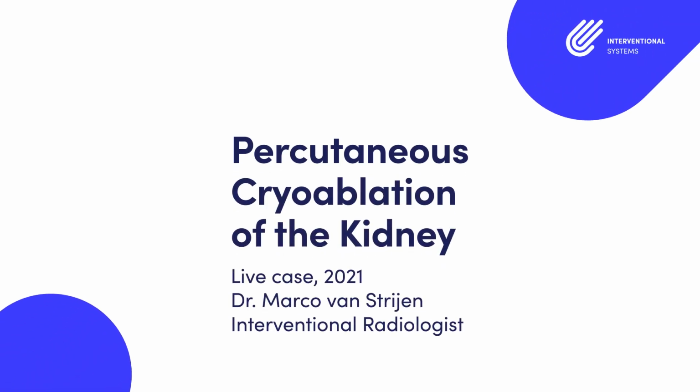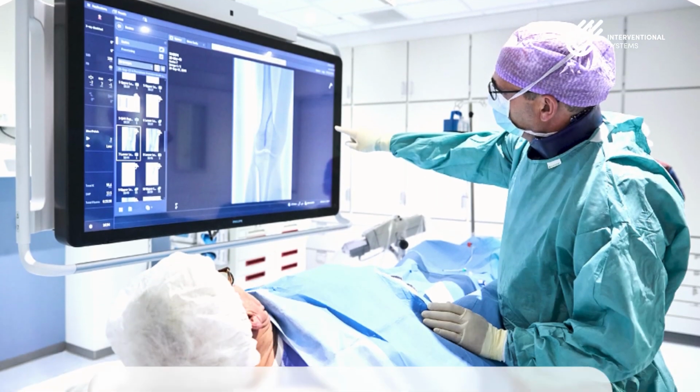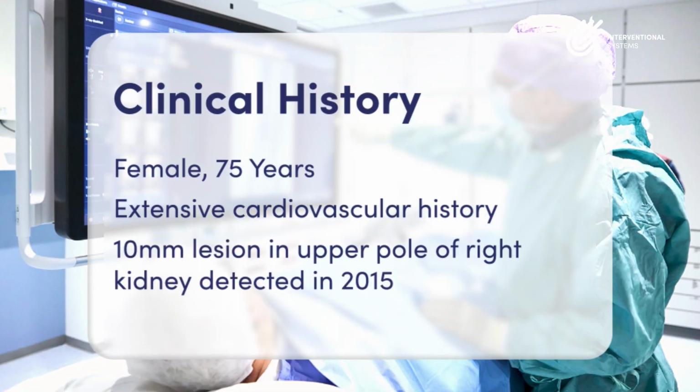This is a live recording of cryoablation with CBCT robotic assistant and the use of the HoloLens, recorded on the 29th of November 2021. The case is about a female 75 years old with an extensive cardiovascular history. She had poor cardiac function and a thoracic aortic aneurysm.